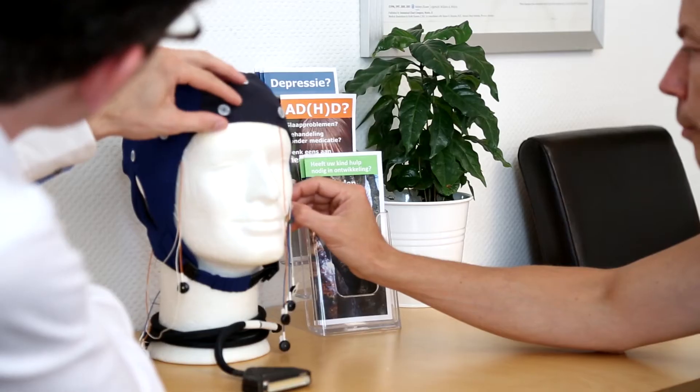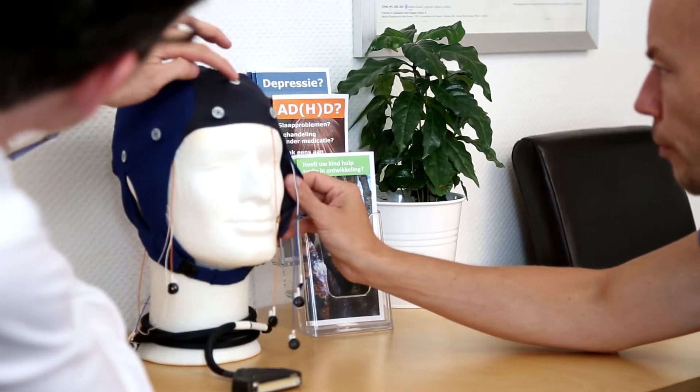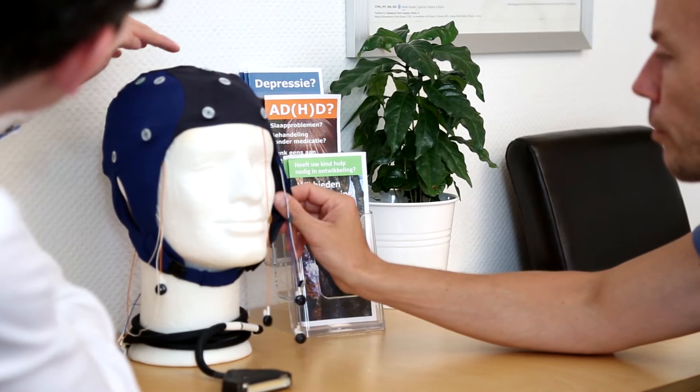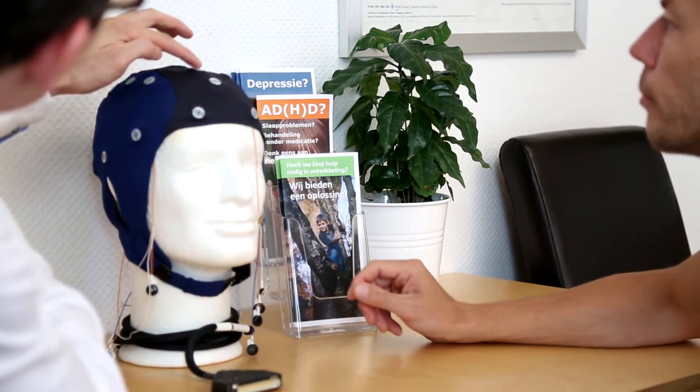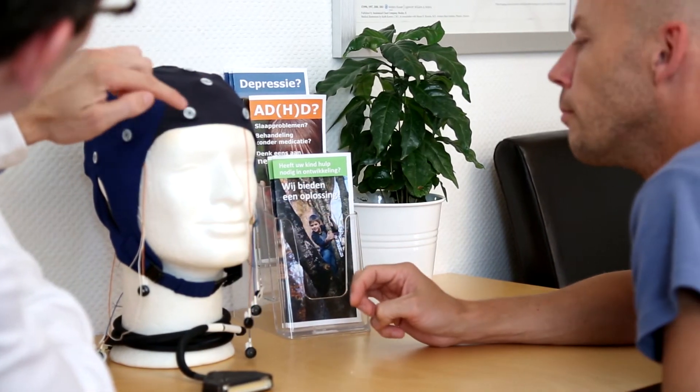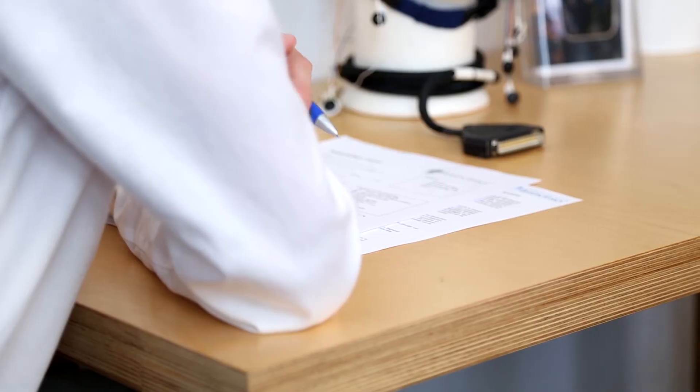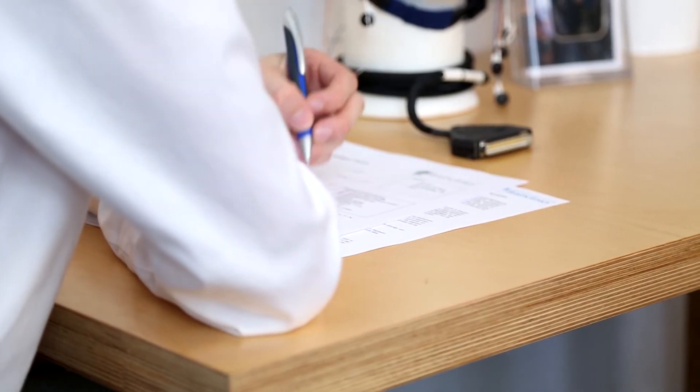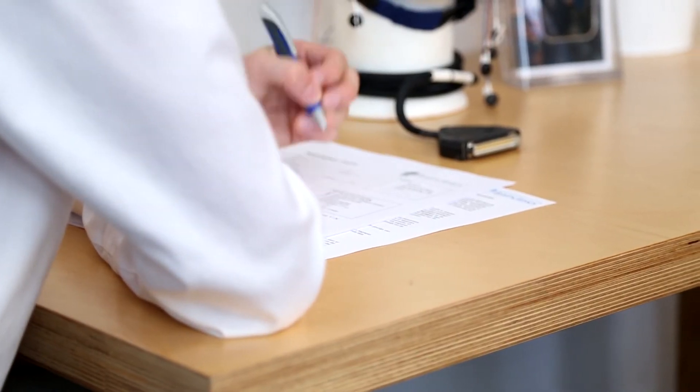First, a brief conversation takes place between the clinician and the client. During this conversation, the clinician will explain the procedures of the QEEG assessment. The client is then asked to complete a number of forms.